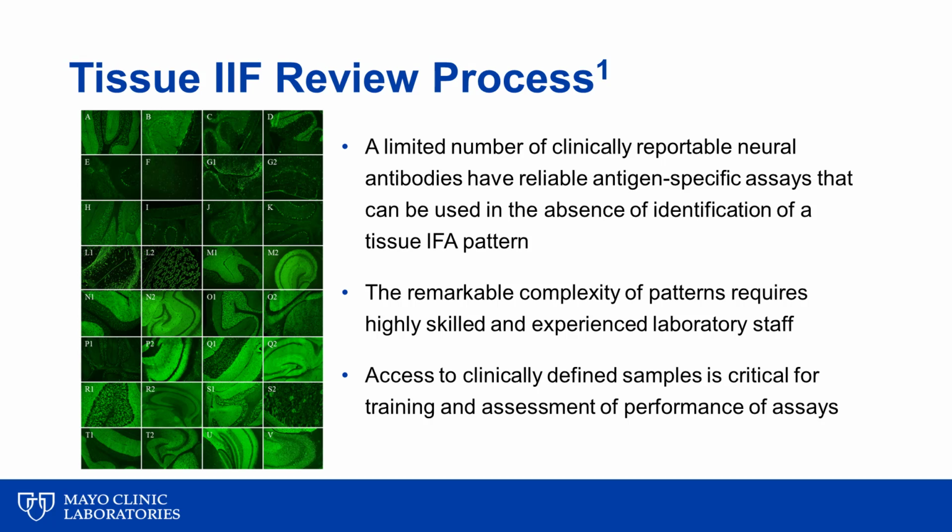The interpretation process itself requires extensive training and expertise and should be augmented through the exposure of hundreds of well-defined clinical samples to refine the interpreter's abilities. Although it's important to note that this is an extremely challenging task for most laboratories.